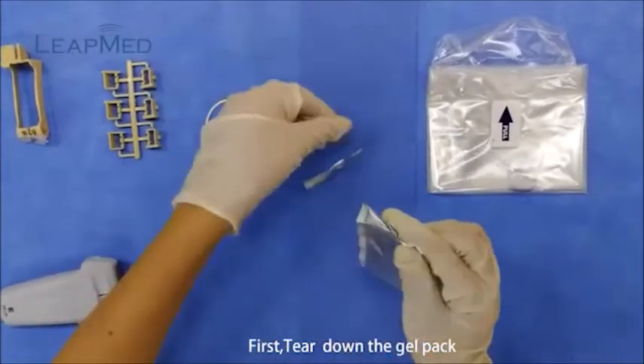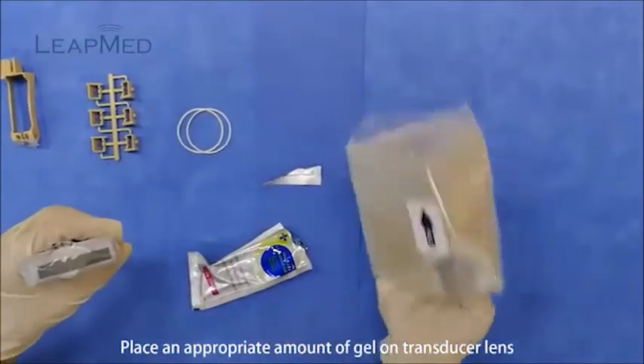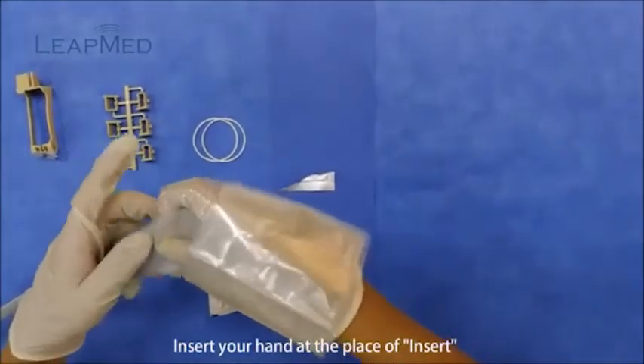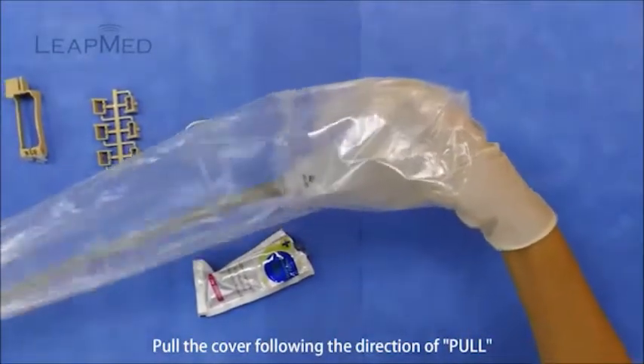First, tear down the gel pack. Place an appropriate amount of gel on the transducer lens. Insert your hand at the place of insert. Pull the cover following the direction of pull.